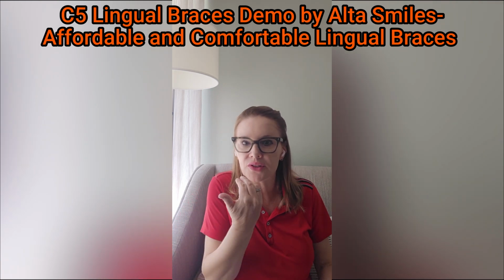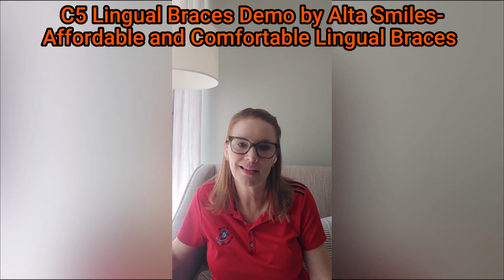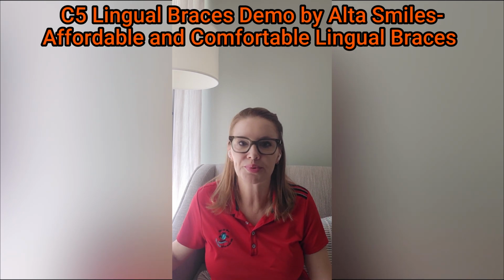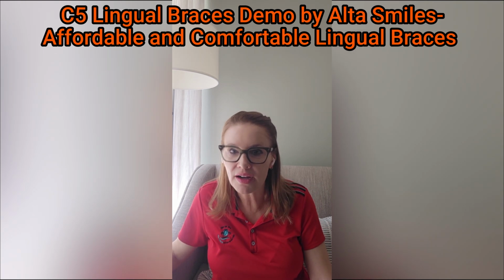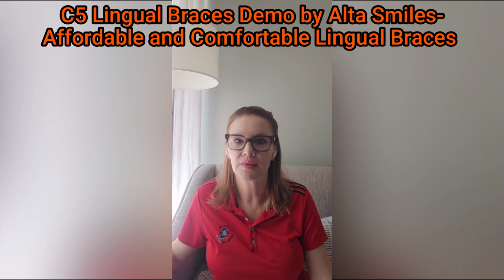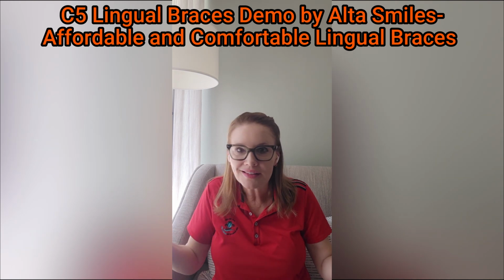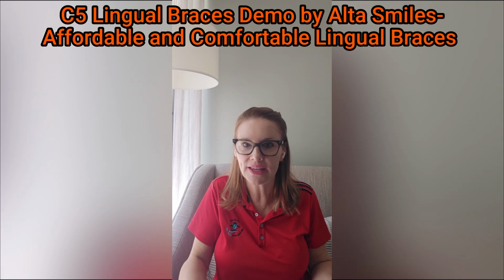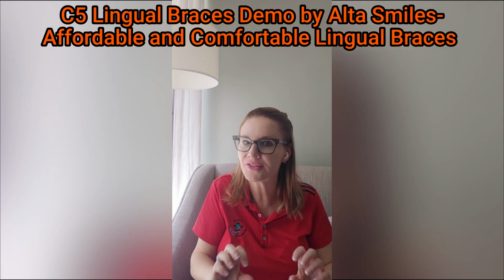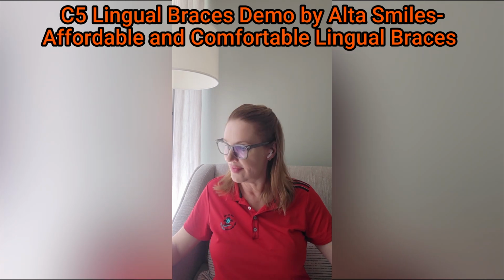But a lot of times people just have relapse on the lower anterior. It's kind of like what we used to use spring aligners for, or maybe an Express Invisalign or a moderate. It's that kind of case, where you don't have that much crowding or spacing. You're going to pick something pretty simple, but it's one appointment: a diagnostic appointment, a delivery appointment, a debonding appointment. So easy. There's nothing to cut up, and there are no changes because it's just a one-time thing. So easy, right? And then a bonded retainer.